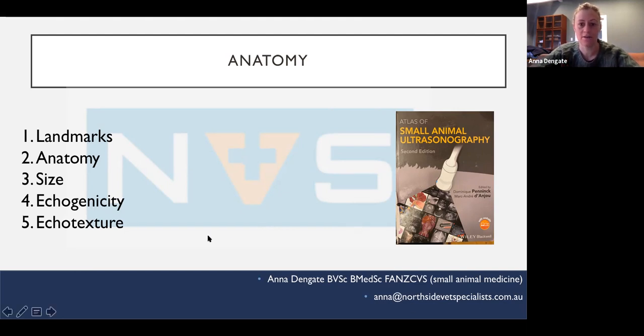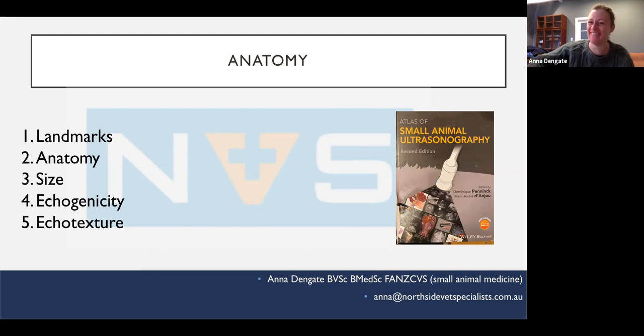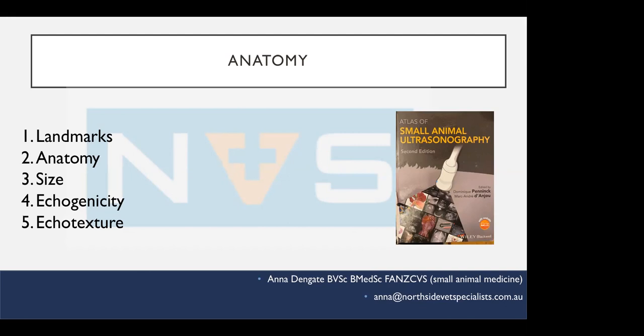All right, so if we're starting to talk about the liver, what are the landmarks of the liver? What does it border on the left-hand side of the body? Diaphragm. Diaphragm, yep. Cranially, diaphragm. Sorry, I meant more on the probe, when you're looking with the probe. Is there a hernia on the right, Josh? Good, so diaphragm. Stomach. Stomach, excellent. What else?